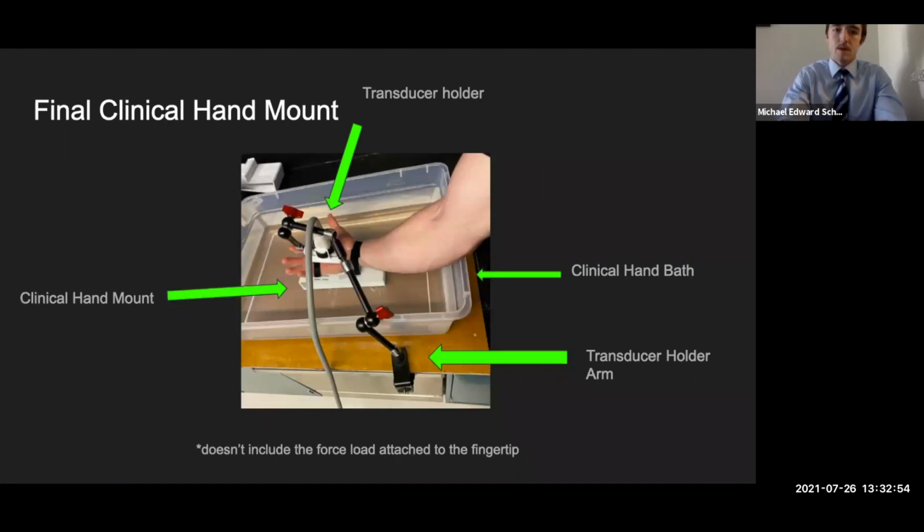Here is a picture of the final clinical hand mount within the setup. You can see the clinical hand bath, the transducer holder arm, as well as the transducer holder.